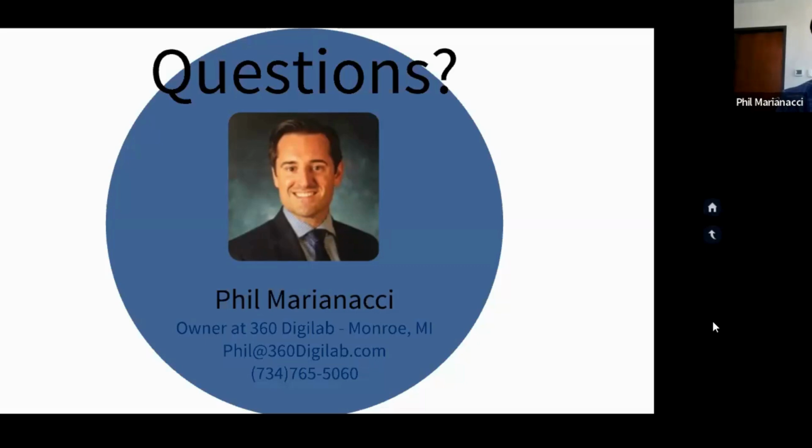Doing that and learning more about what some functions can be for your type of laboratory, or if you're a dentist, I'd highly recommend it, because collaborating with the different partners is key. It really is. It's a way to grow. It doesn't matter if you're a dental laboratory or a dentist. This is a way to capture cases and to build strong partnerships in communication. Being able to plan where the implants can be placed, and having your doctor really rely on you for that, is amazing.